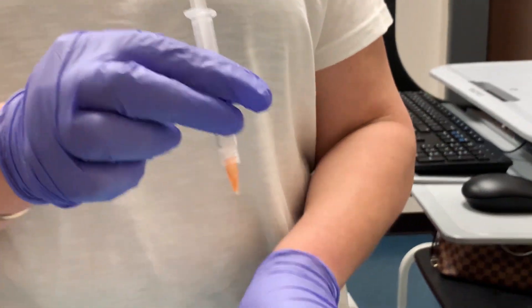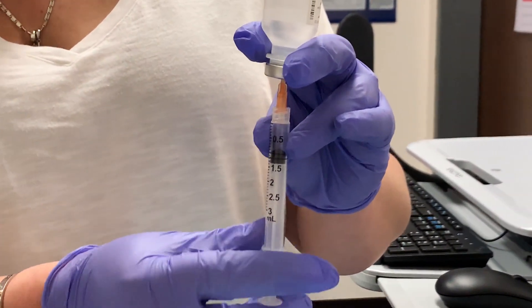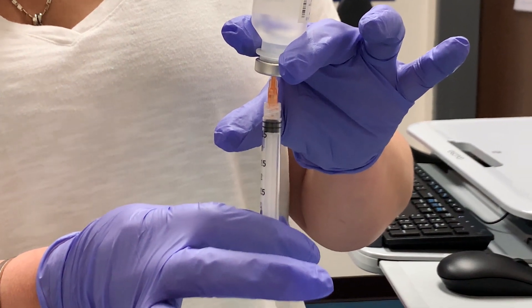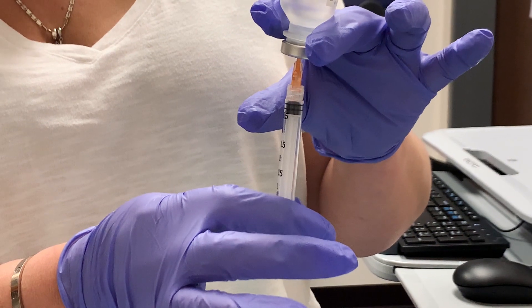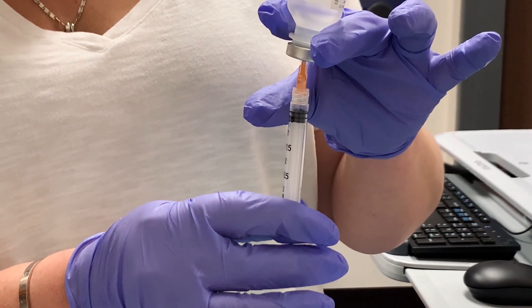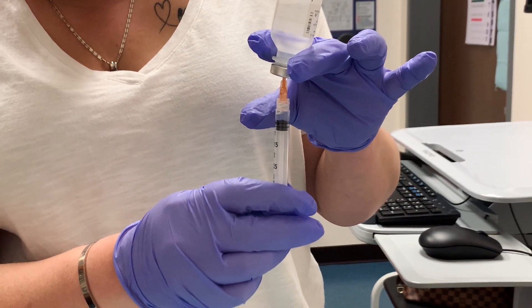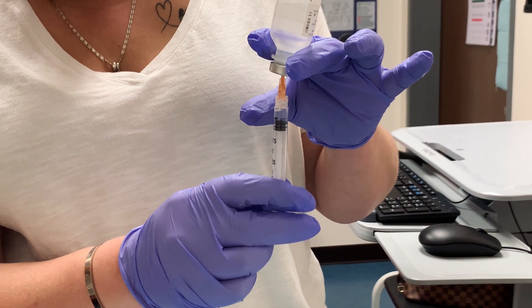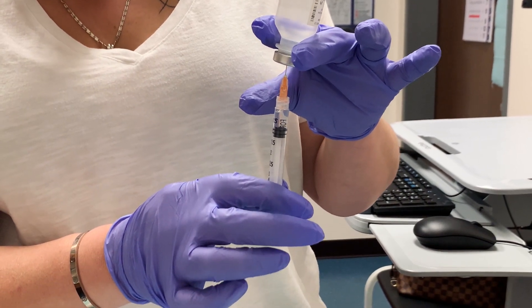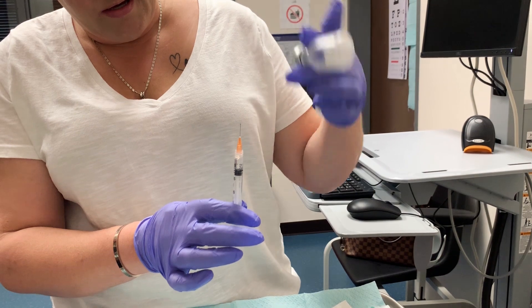I'll pull back to about one mil worth of air, then put the needle into the rubber dam, flip the vial upside down, and carefully push the air in. If you let go of the plunger, the air you just pushed in should start moving the plunger down automatically. When it stops, very gently withdraw fluid into the syringe — the slower you go, the less air you'll pull in. When done, lift the vial off the needle carefully so you don't poke yourself.